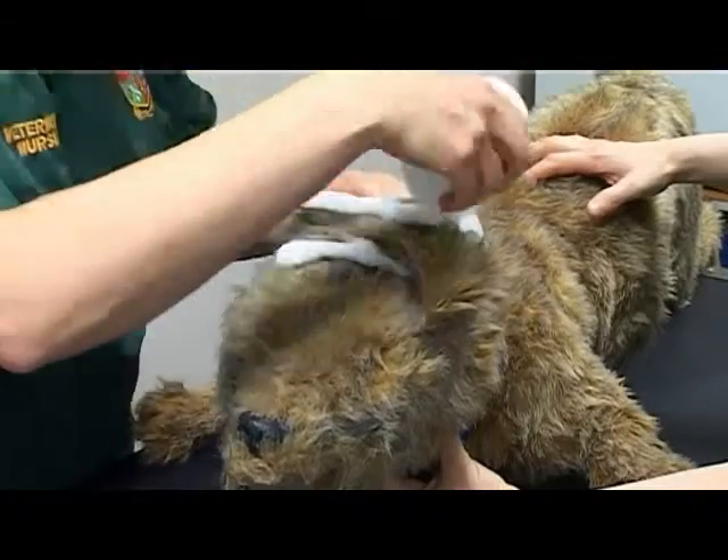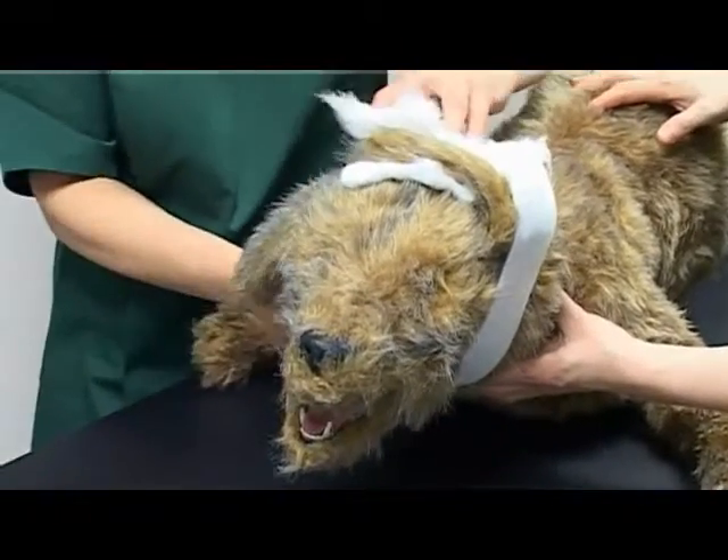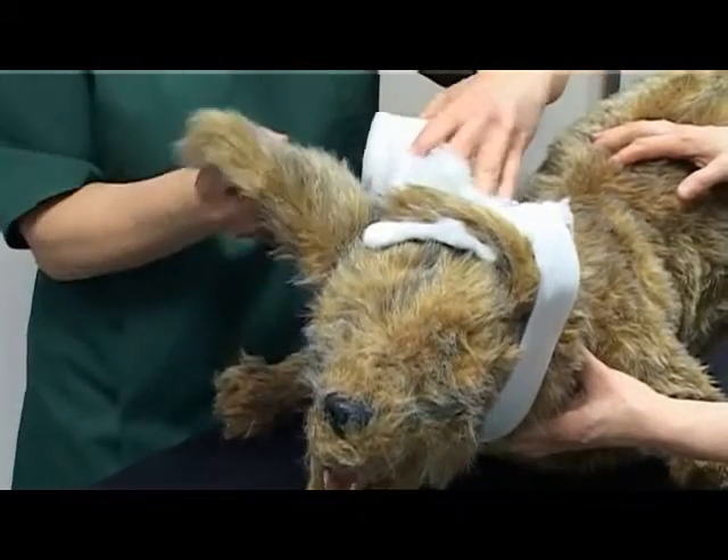Apply a layer of synthetic padding in a figure of eight pattern around the head with the unaffected ear exposed.